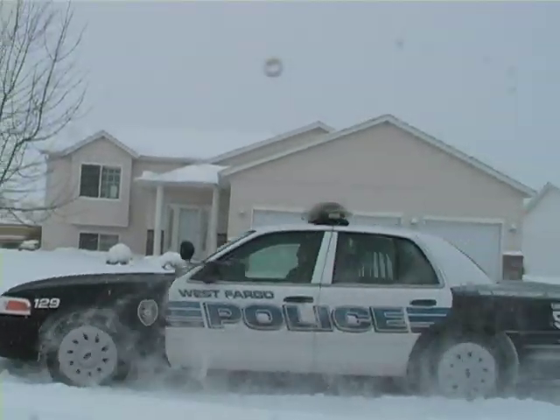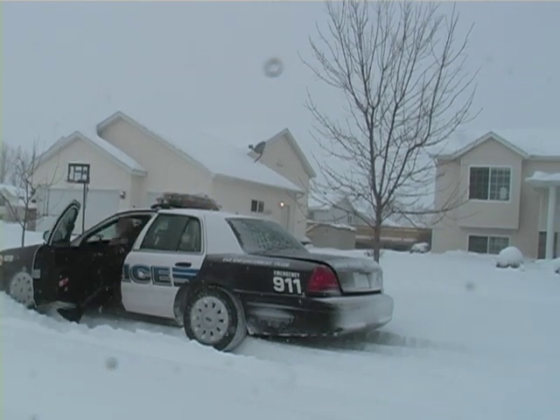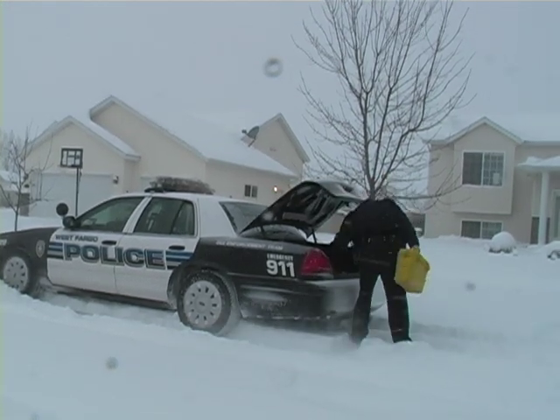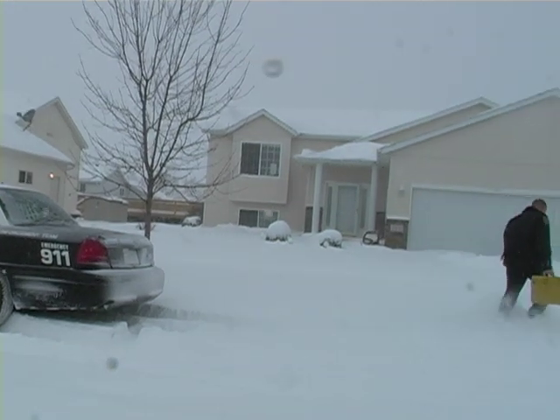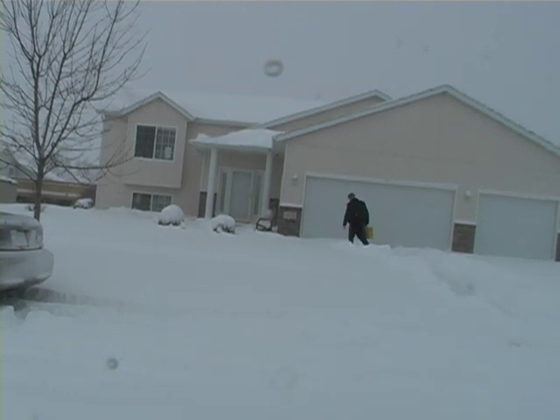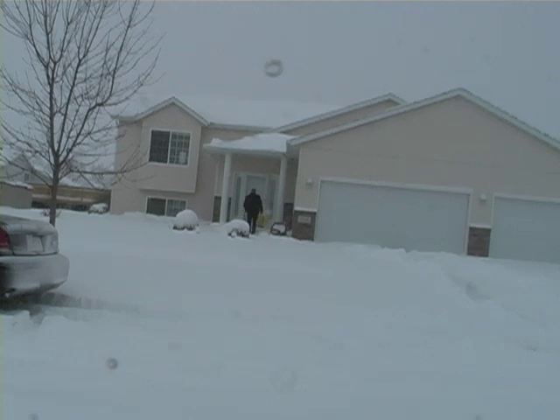If you have to store your AED in a cold place, you may have patches that don't stick very well because they are frozen. You can try to warm them up by rubbing them between your hands. The battery may also be slower because the AED has been stored in the cold for so long. The AED will still work. It may just take longer to analyze and charge. If the AED has an LCD screen, the screen may not work when it's cold, but the AED will still work.